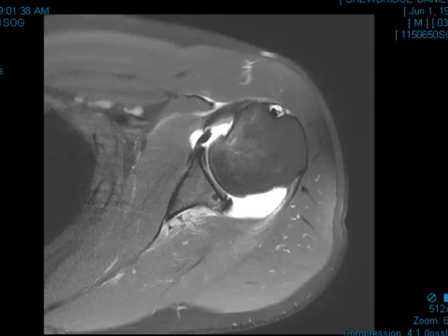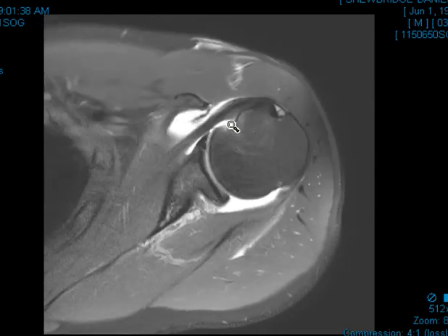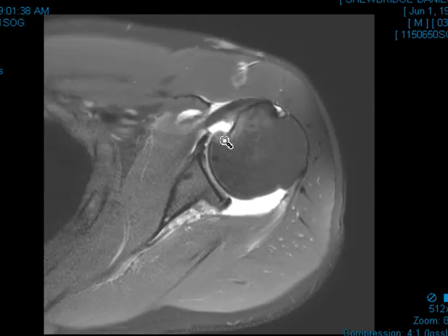Hello, this is Dr. Gay from First Look MRI, and this is a 32-year-old male who has complained with shoulder dislocations. He had one recently, and we did an arthrogram here. We can see that the fluid we put into the joint is white, and it's filling up the joint.